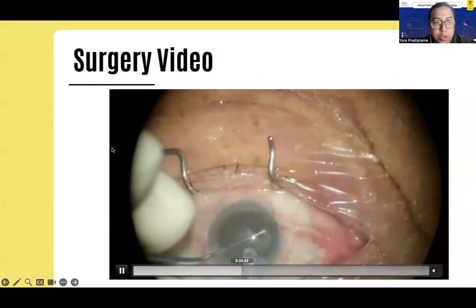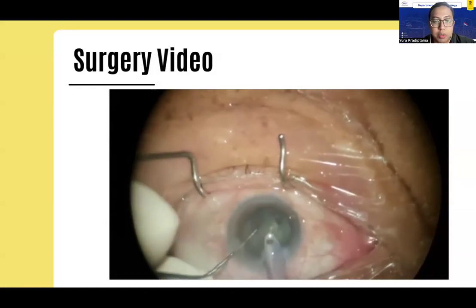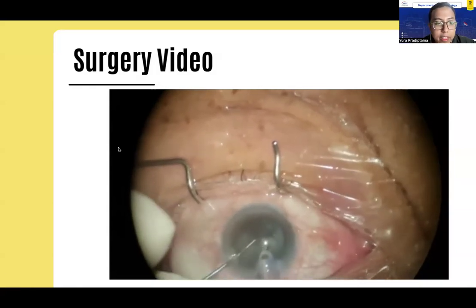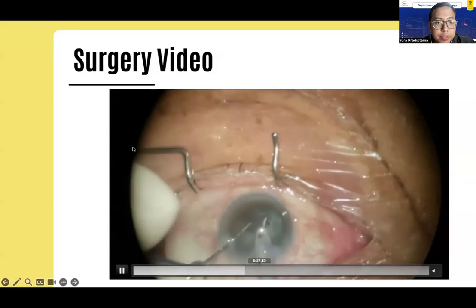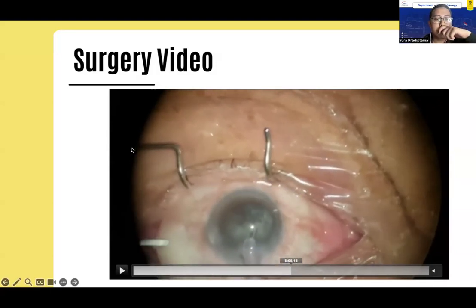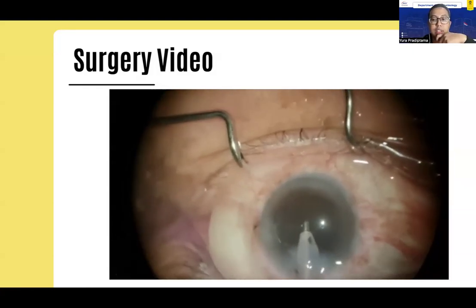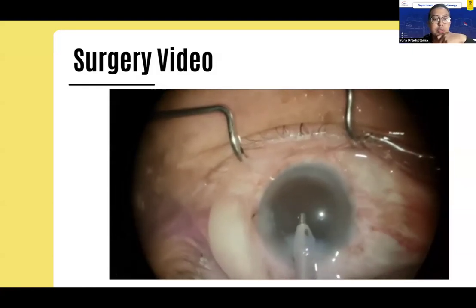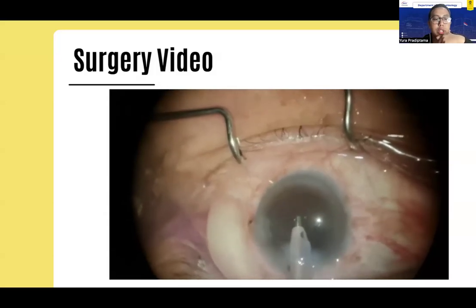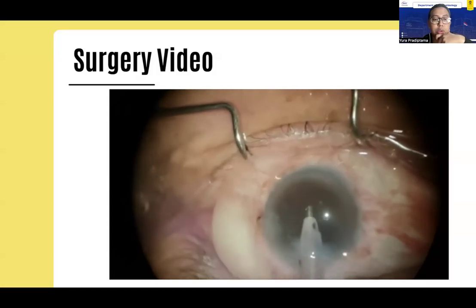After we finished the phacoemulsification, I try to fast forward. In the IA, there are signs that the posterior capsule kept moving, especially in the zonular weakness area, due to its instability.